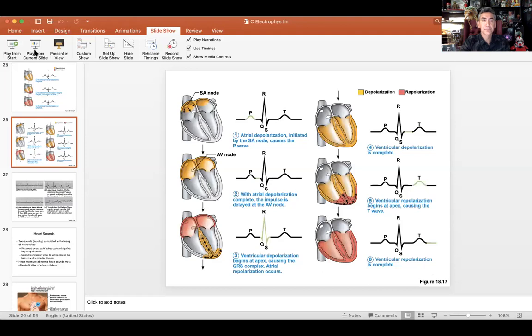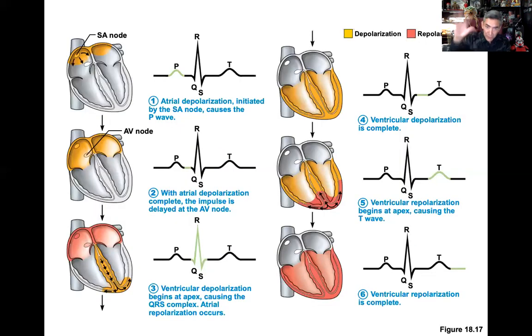Okay, continuing on with the ECGs. So once you've reviewed all of that, we're ready then to start our ECG interpretation. This is going to be some stuff that I'm going to upload for you, some little worksheets to get you practice, to get you able to interpret something healthy, something an emergency, something like that.